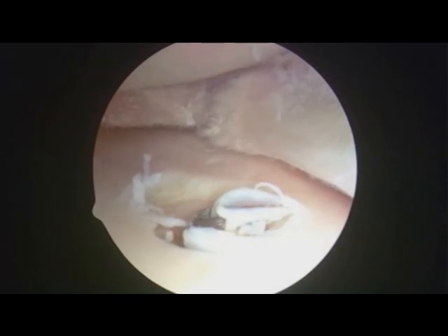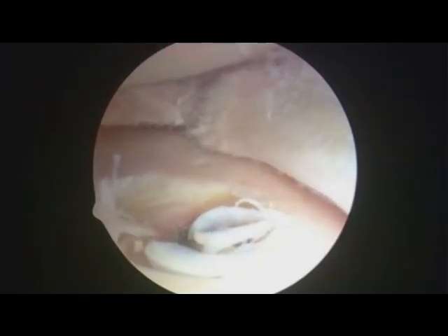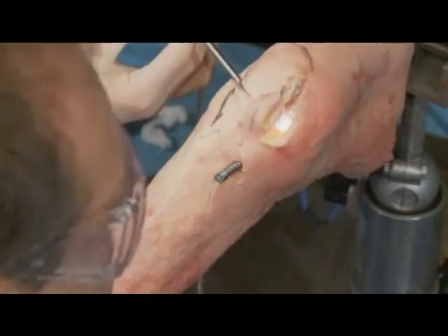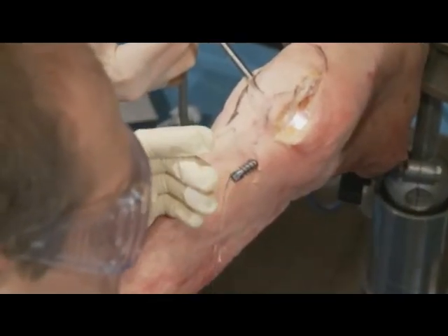So what we do is we then turn the screw over, so that I'm going to show you what this setup looks like on the outside here, so that you can see how the screw and everything all lines up. Just hold the scope here for me for a second. Can you unlock that?